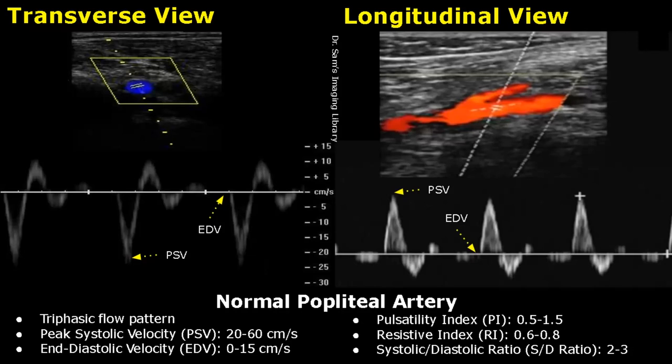The pulsatility index is between 0.5 to 1.5, the resistive index is between 0.6 to 0.8, and the S/D ratio is between 2 and 3.2.